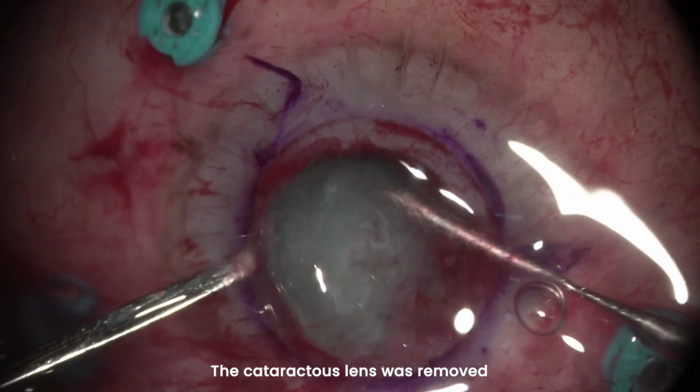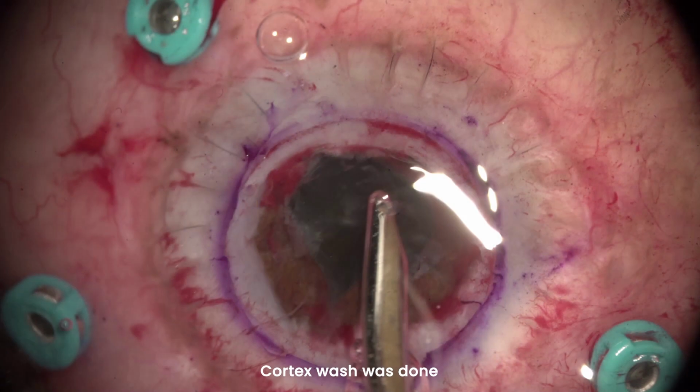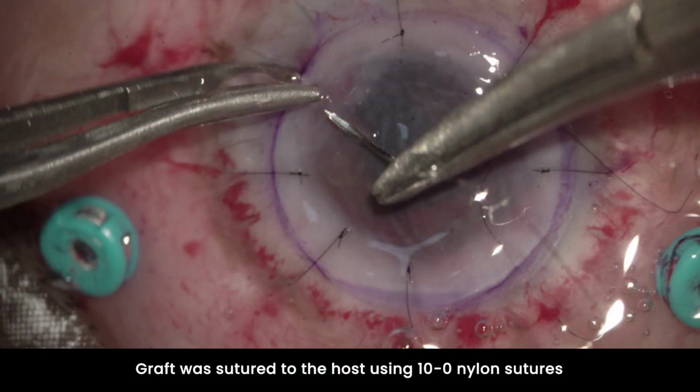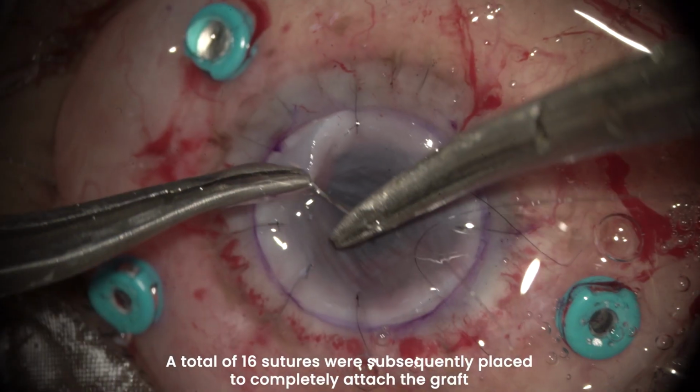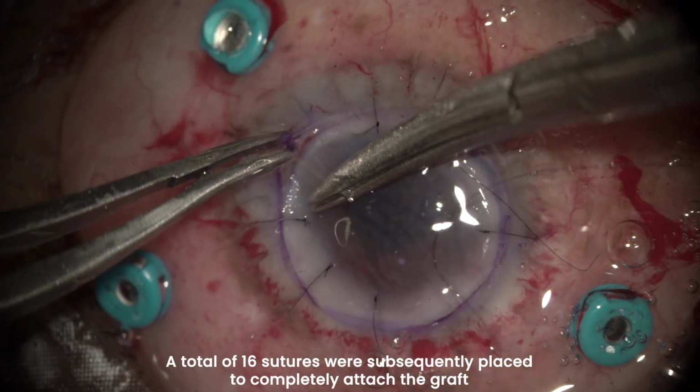The cataractous lens was then removed, and cortex wash was subsequently done. The donor corneal graft was placed. The graft was sutured to the host using 10-0 nylon sutures. A total of 16 sutures were secured to completely attach the graft.